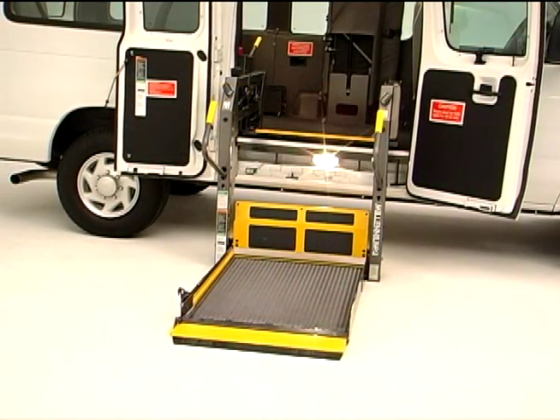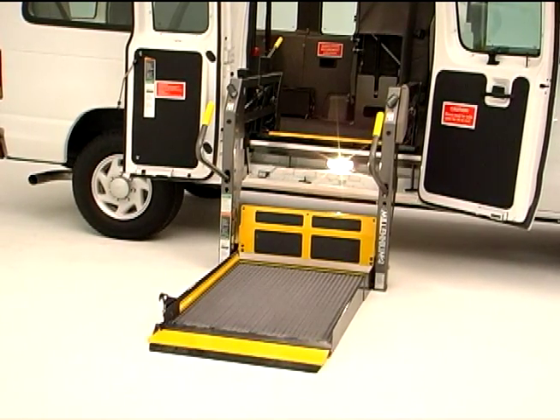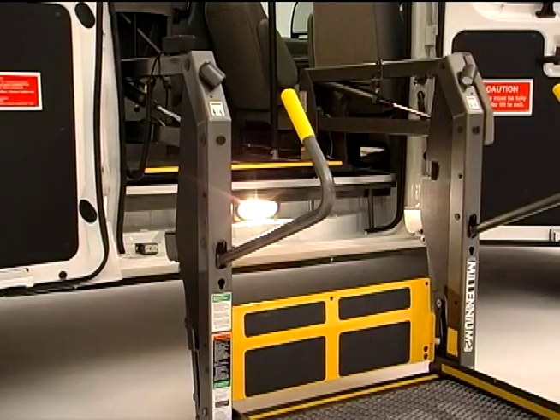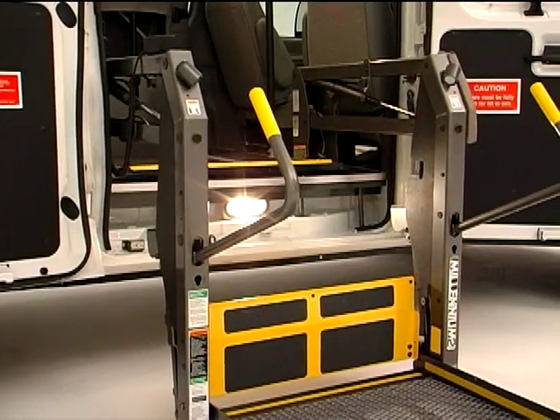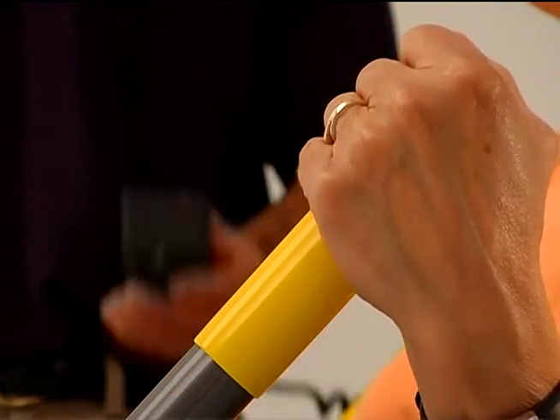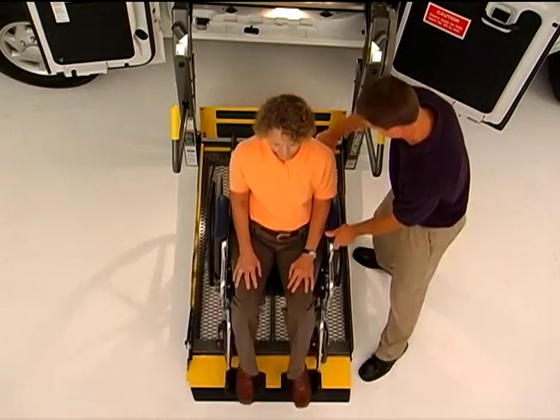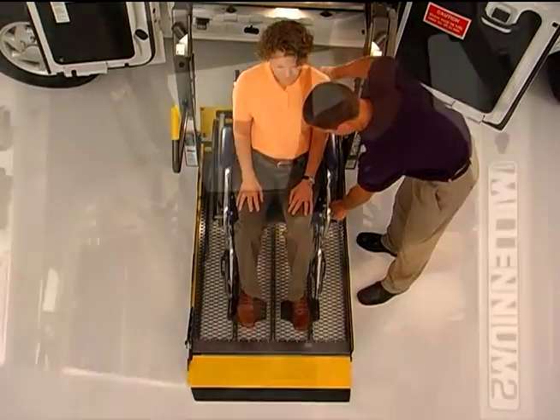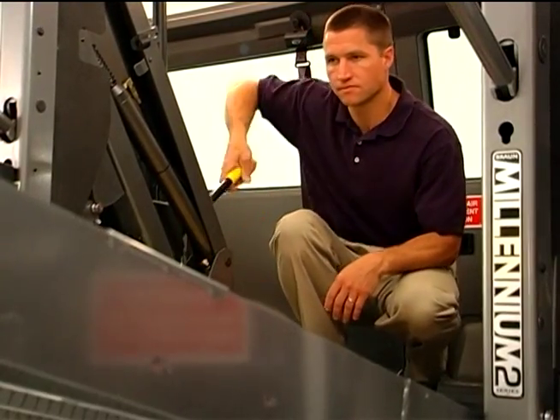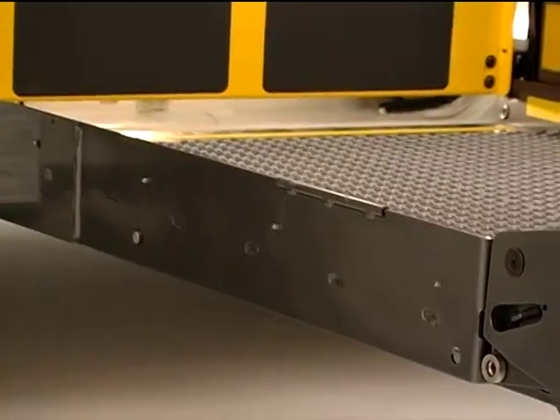Once your inspection and paperwork are complete, you're ready to learn about the proper operation of your Braun Millennium Lift. In this video, you'll receive an overview of the Millennium Lift, its safety features, and basic precautions that will help to safeguard both you and your passengers. We'll show you how to properly load and unload passengers, operate the lift using the manual backup systems, and perform basic preventive maintenance.